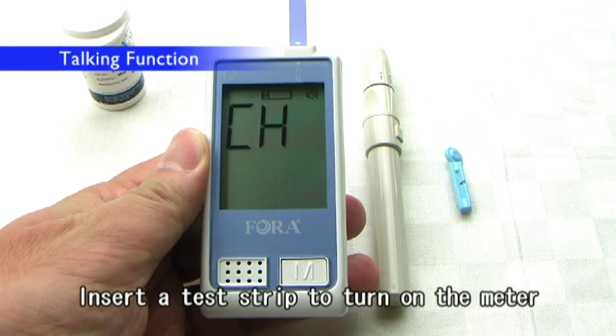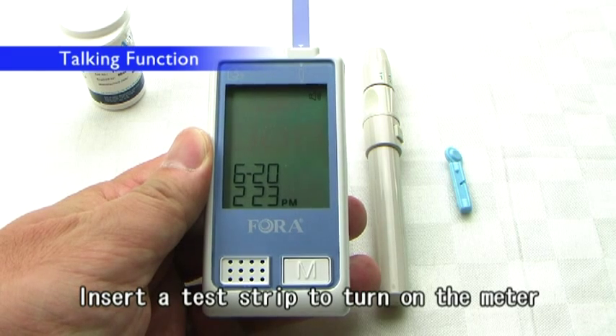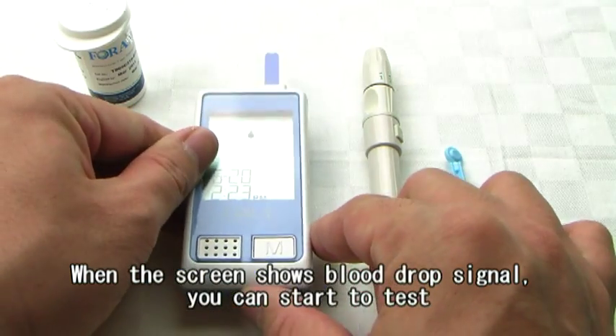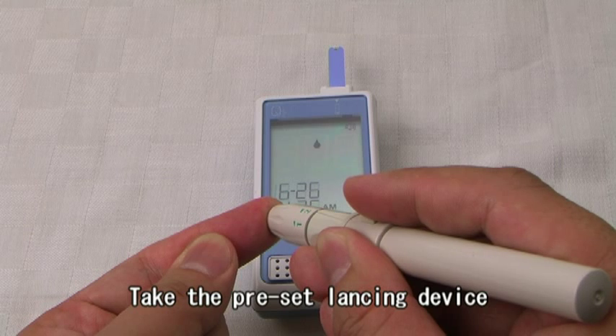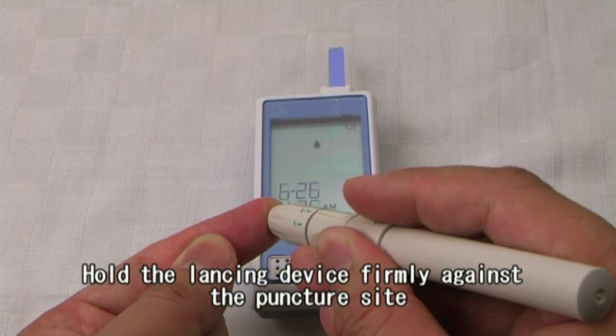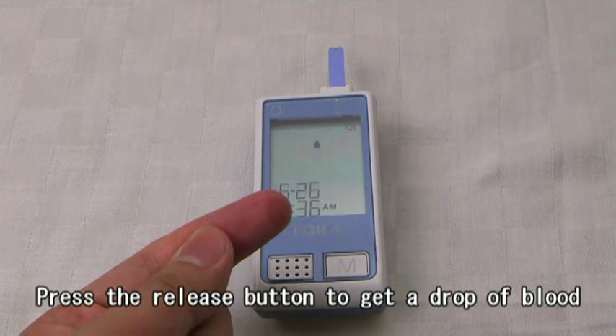Please relax during measurement. When the screen shows the blood drop signal, you can start to test. Please apply blood into the strip. Take the preset lancing device. Hold the lancing device firmly against the puncture site and press the release button to get a drop of blood.